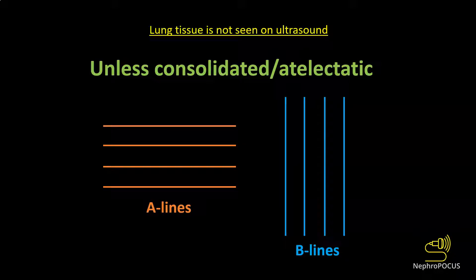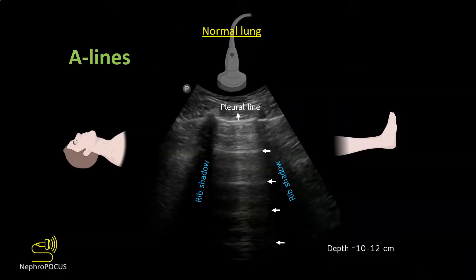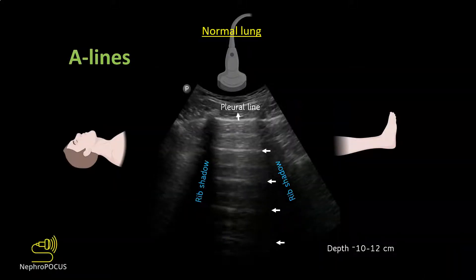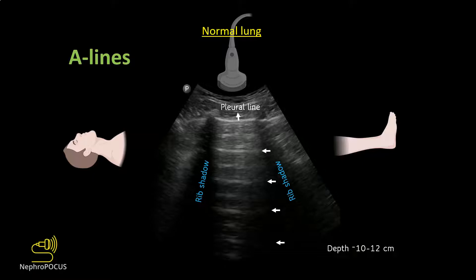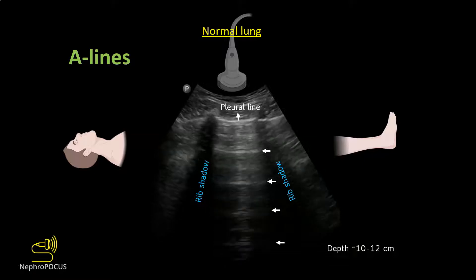If you are seeing horizontal artifacts, which are called A lines, that means it's normal lung. If you are seeing vertical artifacts, which are called B lines, they indicate increased extravascular lung water. This is how a normal lung looks like on ultrasound.